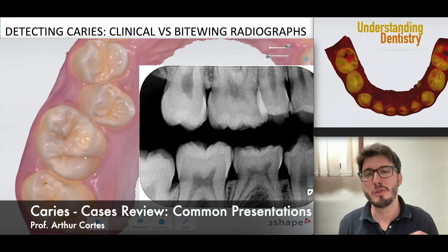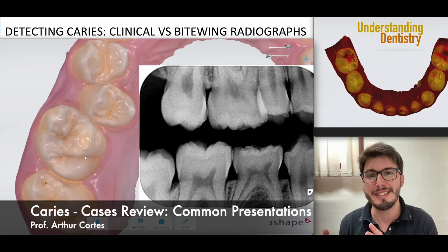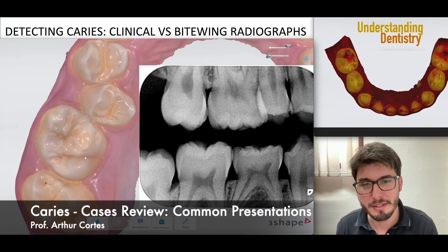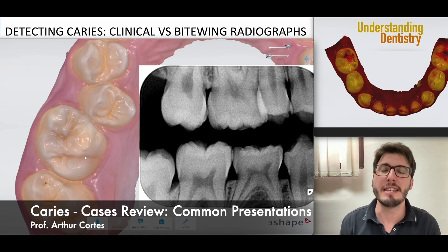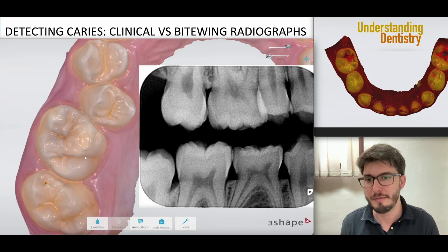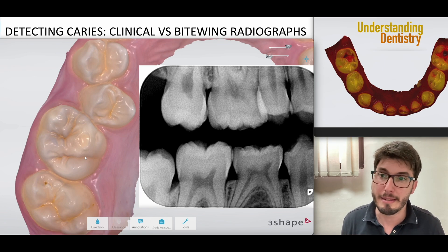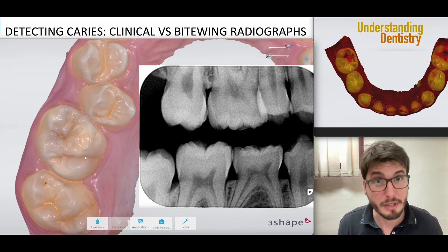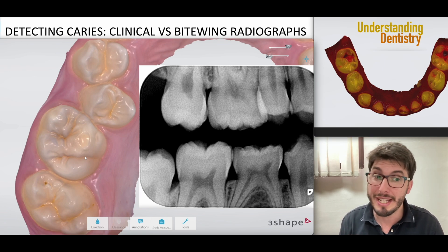Hello guys, we are going to show you the clinical presentation and correlate it with the bitewing radiographs. This is a video for us to understand the presentations of caries.